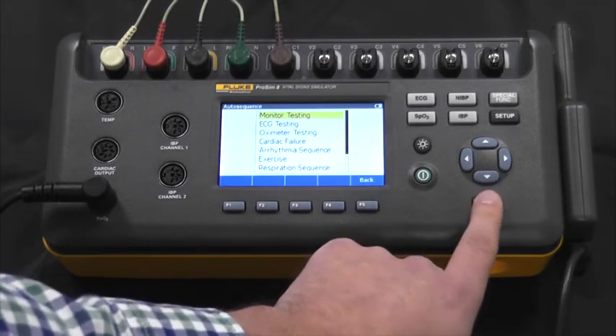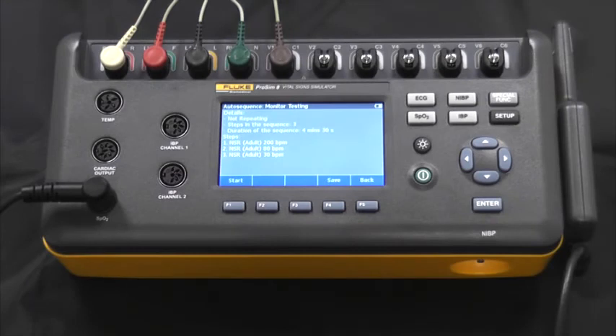If we go into the first one, monitor testing, we can see that there are three steps. If we were to start this, the three steps would be performed and the results would be displayed to us to manually save as pass or fail.